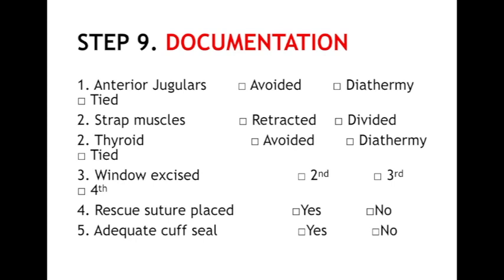Finally, appropriate documentation using either paper-based or electronic patient record systems should be performed. The most important surgical parts of the procedure noted, together with the type and size of the tracheostomy tube placed. It must be remembered that the ongoing management of these patients may include transfers to other institutions, and appropriate information regarding the tracheostomy placement must be freely available.